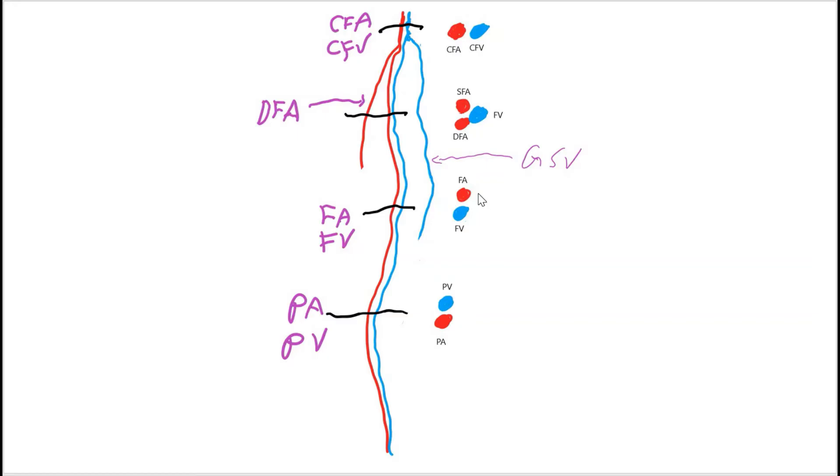Continue to move down, it's the femoral artery and the femoral vein. And behind the leg we have the popliteal vein and the popliteal artery. Notice how the orientation of the vein and the artery switches. Behind the leg you have the vein on top and the artery on the bottom of the screen, whereas all the rest we have the artery either more superficial or on the left side.